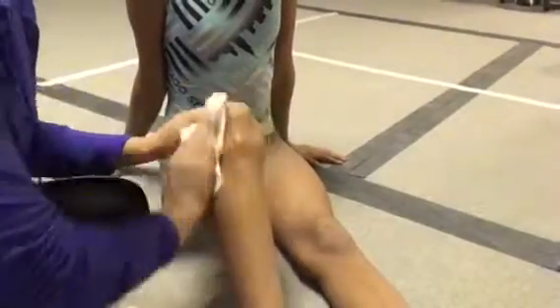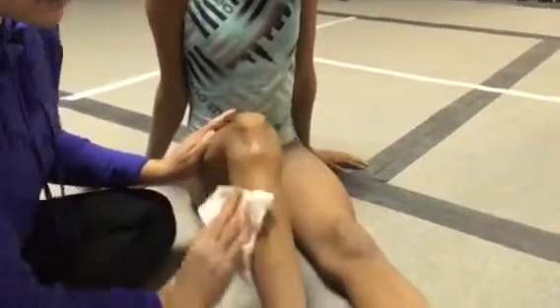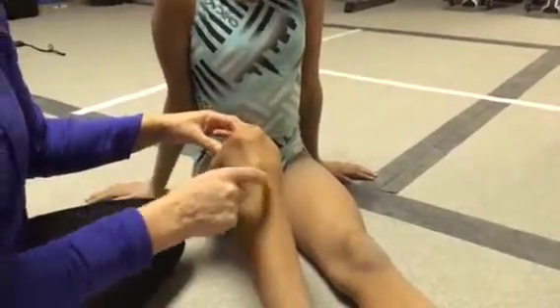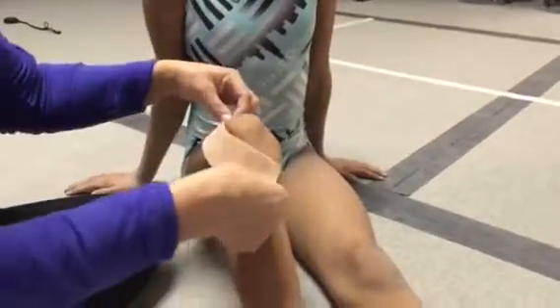We're going to wipe down the area so that the tape adheres well. This is called the tibial tubercle — that bump right there — and that's where she's having pain. We're going to be crossing two pieces of tape over that.